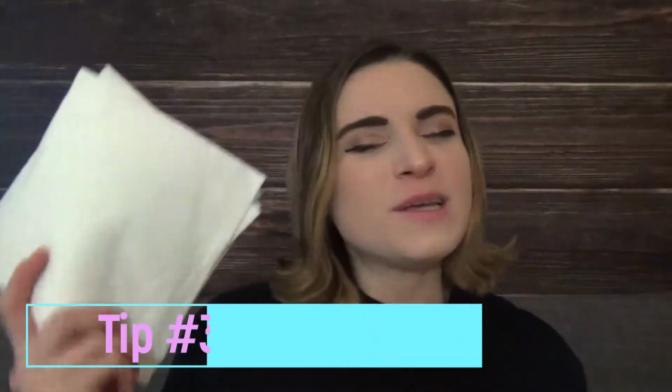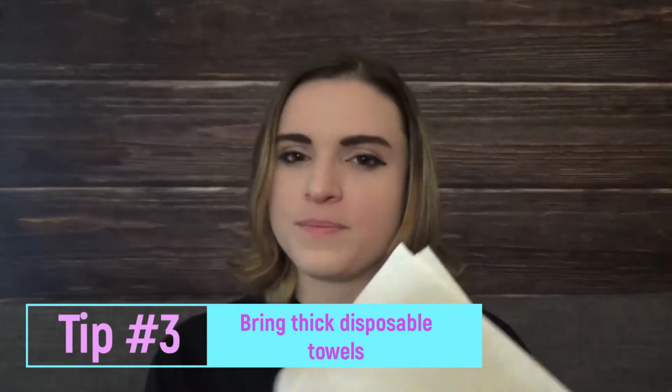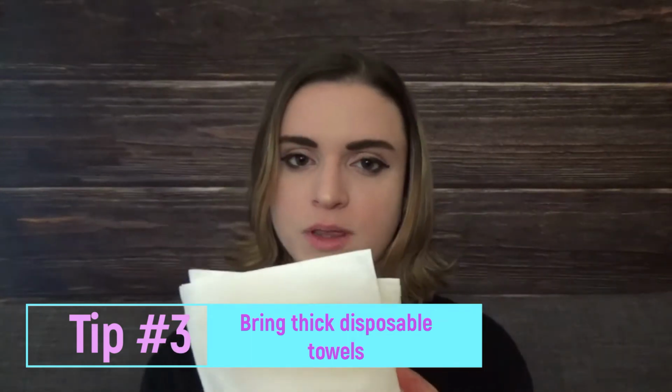And one of the other little simple things I want to recommend to you guys when you're traveling is to have thick, very absorbent towels with you, disposable. These guys are nice. I would relate them to very thick tissues. They're great to have at the airport or at a hotel. Sometimes the airport will have thinner toilet paper, not the best if you're trying to clean up your ostomy or you've had a leak and you need a lot of help, or maybe you're dumping that day and you want to have something to press against the stoma so that you can keep it dry so you can put a bag on.